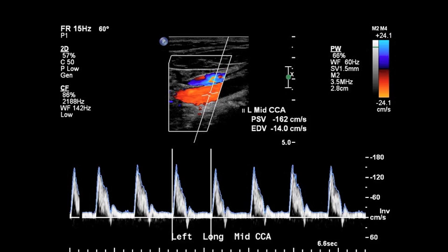In the prior example with the spectral Doppler, the beam line we were interrogating was steered to the right, which is most intuitive for people. But in this example the beam line is steered to the left, and so what has to happen at that point is that for our waveform to be represented above the baseline there has to be some kind of inversion.